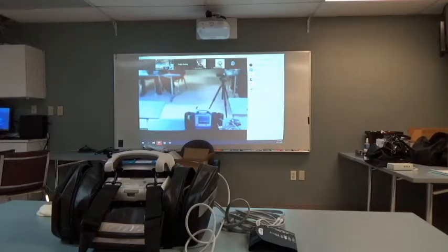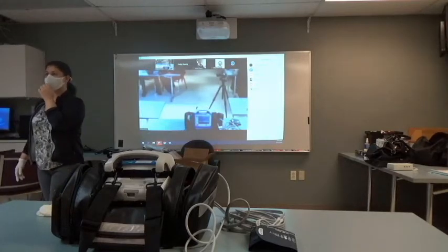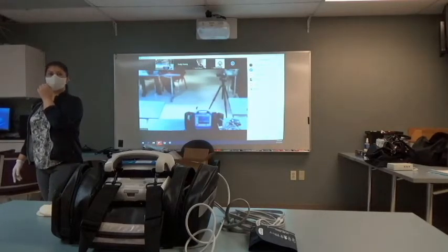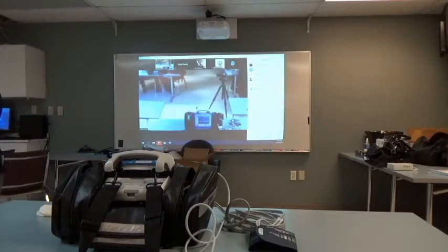How do I stop the printing? Which button did you hit? The camera? Yeah. You can hit the roll of paper and it'll stop it, or you'll just wait and it'll stop on its own. Where's the roll of paper?